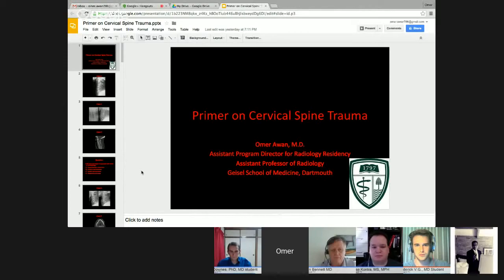All right, so this is a talk on a primer on cervical spine trauma. This is an introductory lecture, from a radiology standpoint, on how to assess the cervical spine, and often as residents and fellows who are training, it's difficult. The cervical spine can be a very challenging topic in terms of figuring out what is going on, what type of injuries there are, and what type of mechanism is involved, whether it's a hyperflexion injury, hyperextension injury, and that sort. So this talk is going to help demystify those concepts and give everyone a basic understanding of how to approach the cervical spine in terms of trauma.